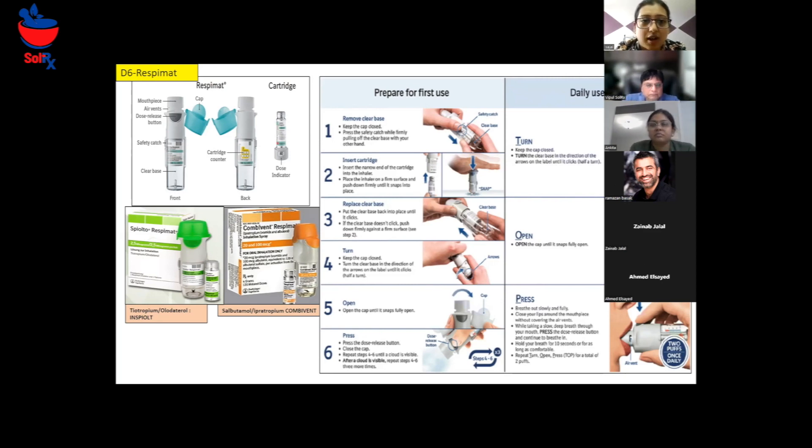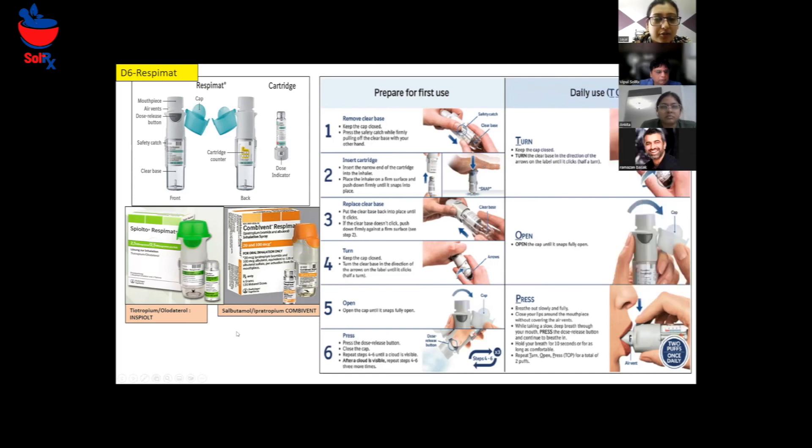Okay, so I will tell you first what ResPimet is. It has a mouthpiece and a cap — the blue color cap you can see. And then there is a dose release button, which helps to release the dose for you. And then there is a clear base, and a dose indicator which will tell how many doses are left.